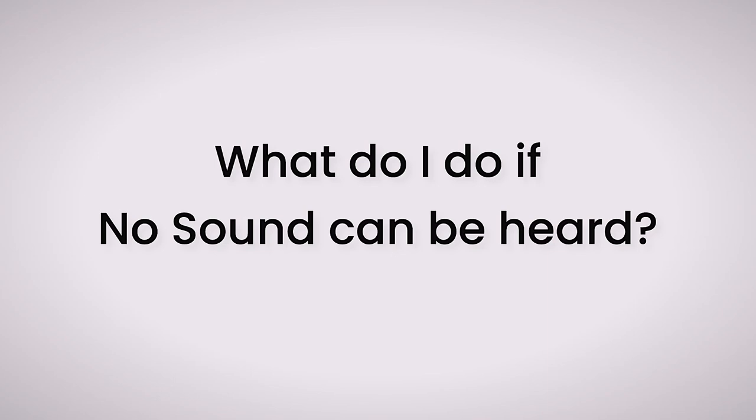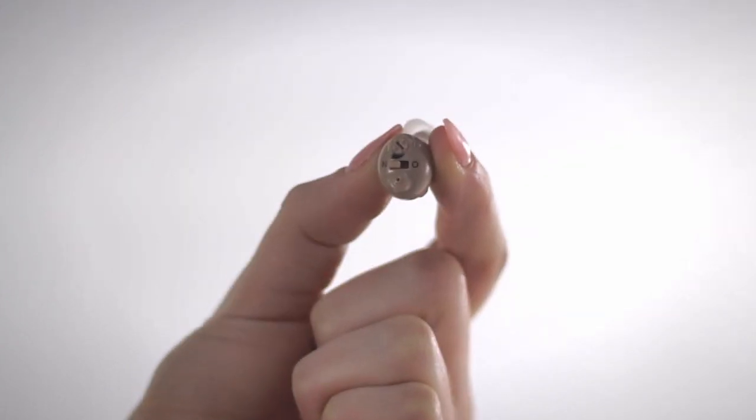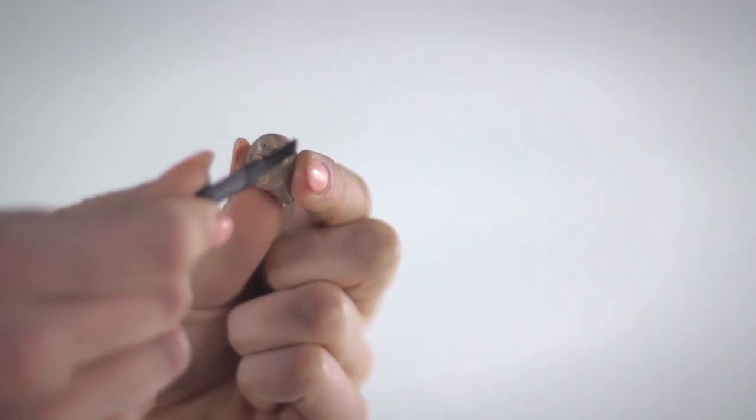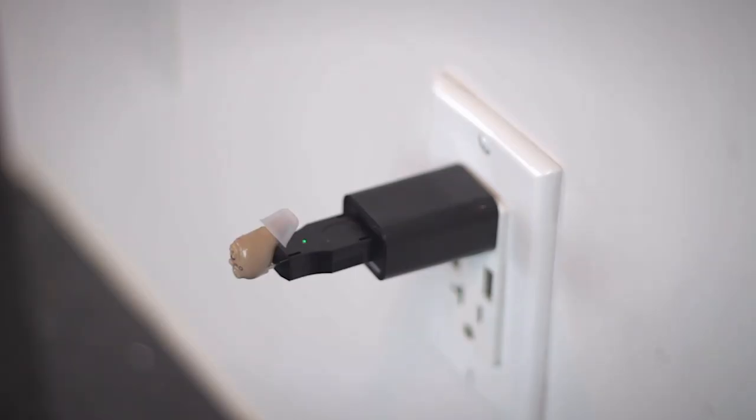What do I do if no sound can be heard from the hearing device? Check to make sure the hearing device is properly switched on. Ensure the microphone is not blocked or dirty. And charge the battery as it may be low.